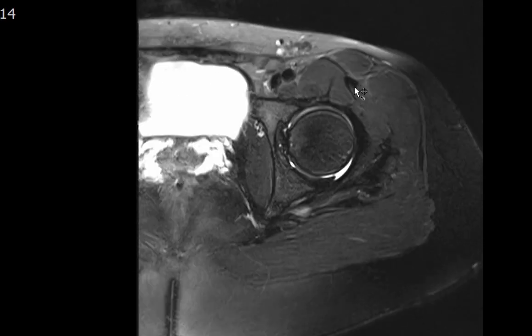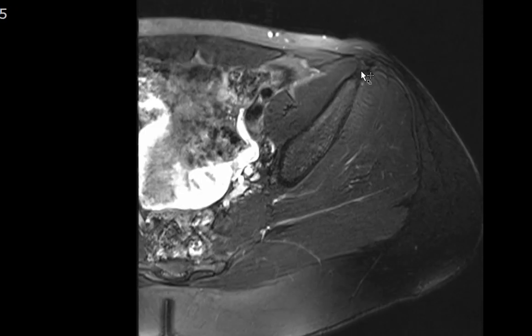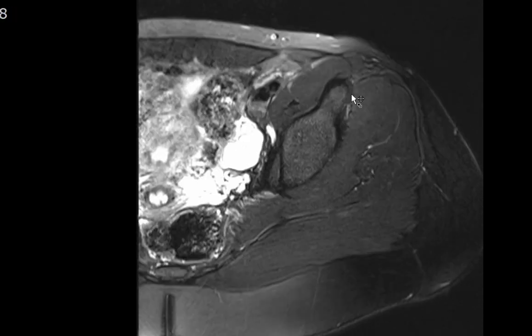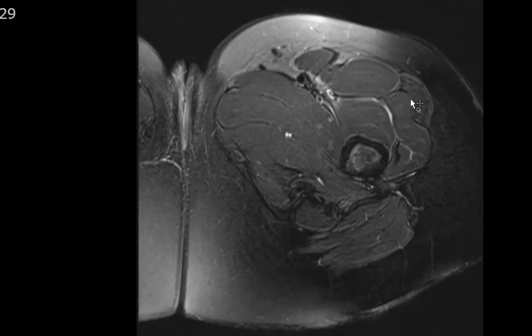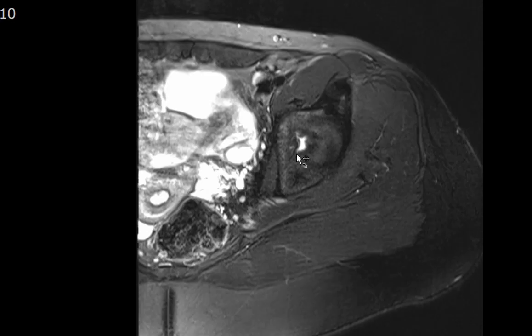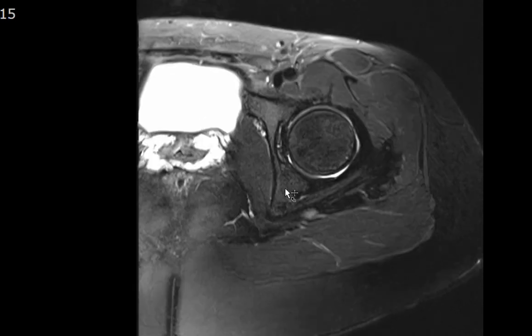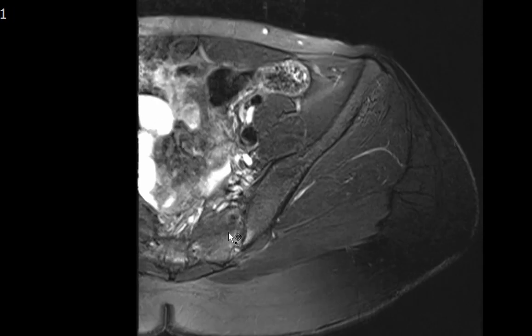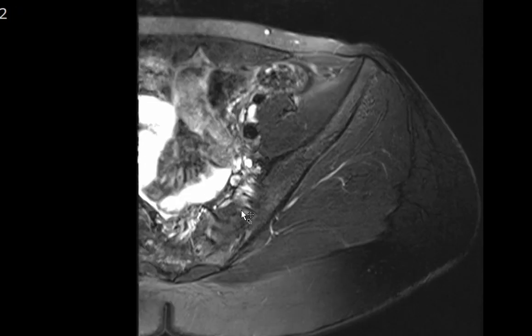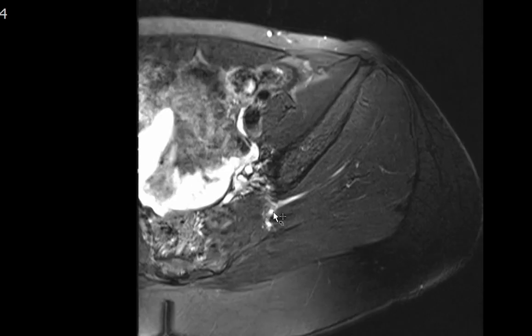The sartorius inserts onto the anterior superior iliac spine. The rectus femoris inserts onto the anterior inferior iliac spine and has a straight and reflected head. The tensor fasciae latae also contributes fibers to the iliotibial tract. The obturator internus and externus muscles are identified here. The piriformis muscle is seen, and all muscles are normal with no muscular edema. The sciatic nerve is seen coursing right over the piriformis muscle.